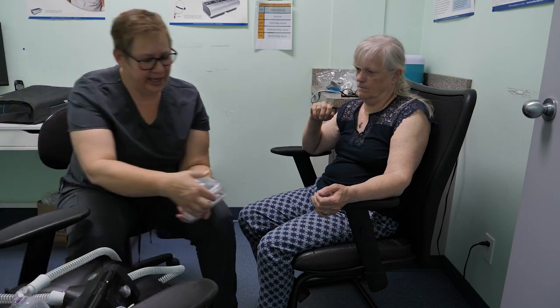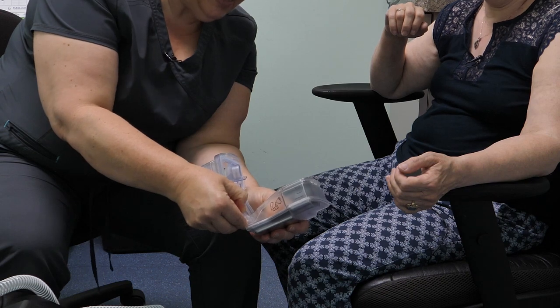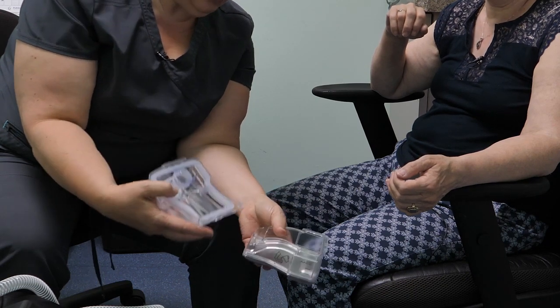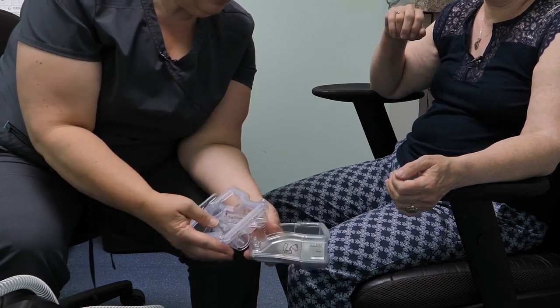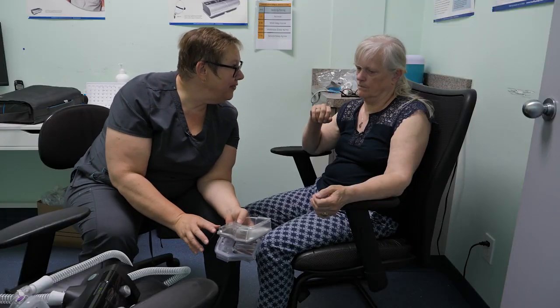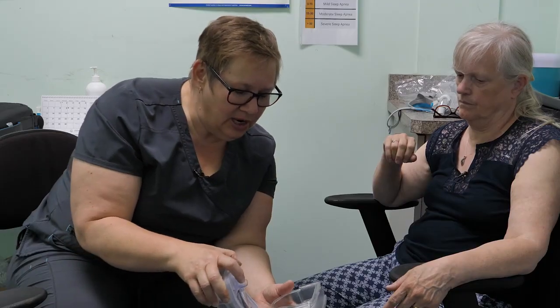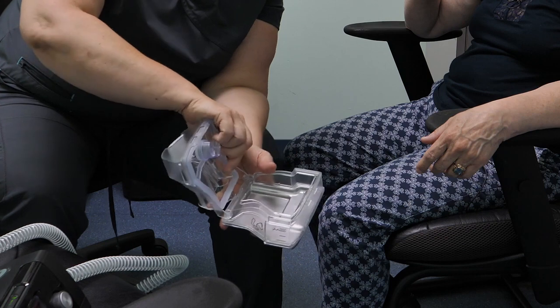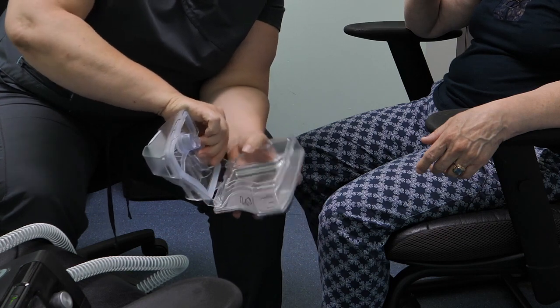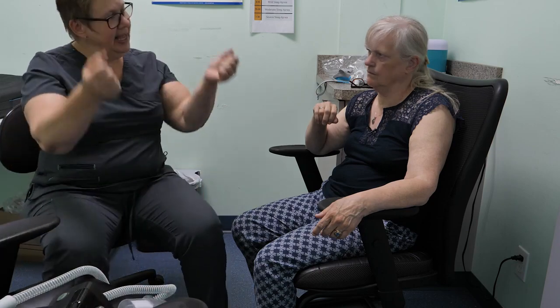So the chamber actually can come apart. You just pull on the side very, very gently and it's going to lift off, okay? The gasket can come out. So you can take a soft cloth and get in there and wash your humidifier. Can I immerse it in water? Yep. And then you're going to put it all back together, okay? So that's the humidifier. The hose, you're just going to wring it back and forth with the water in the hose just to make sure everything is nice and clean.